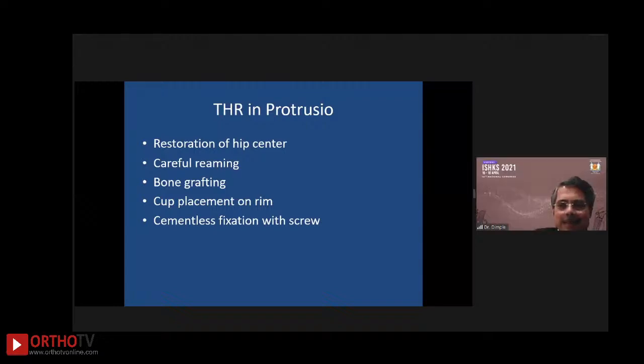Yeah, can I make one comment? Yes, Dr. Bhosle. Wonderful. He has done a wonderful job. Everything is stable. But a few additional things: if you see, osteoporosis in rheumatoid is very common. And there was a little fracture, which will be better seen on CT.